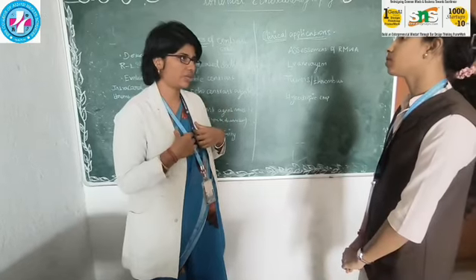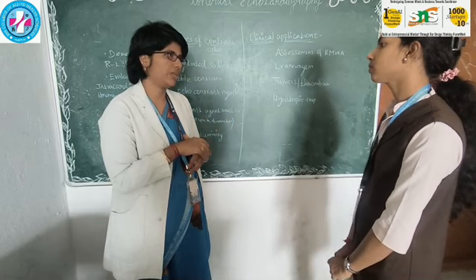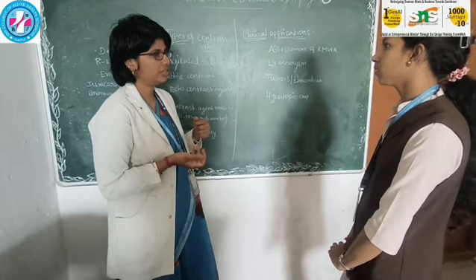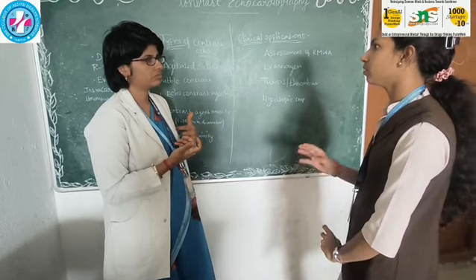Sometimes there is coagulation along with it as well. So for that complication, we prefer the normal saline. So then the agitated saline is taken, then what do we do? Any idea? Through echo, we will be seeing the presence of shunts.